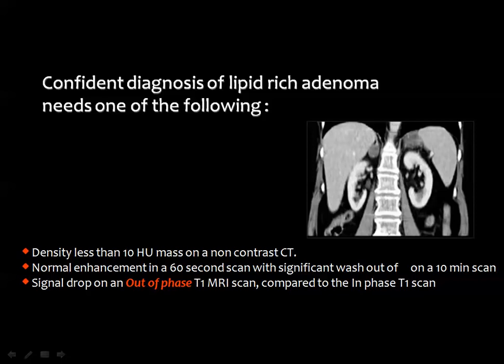Then, for the confident diagnosis of lipid-rich adenoma, you need one of the following, or some of the following. Number one, density less than 10 Hounsfield unit on non-contrast CT scan. Normal enhancement in the 1-minute scan, with significant washout on a 10-minute scan.